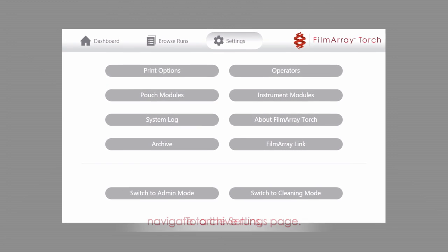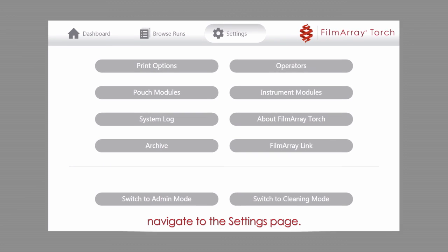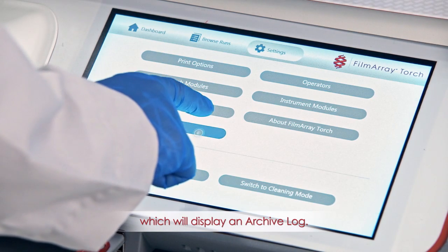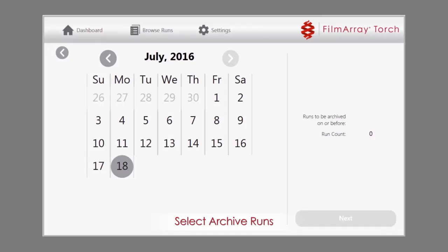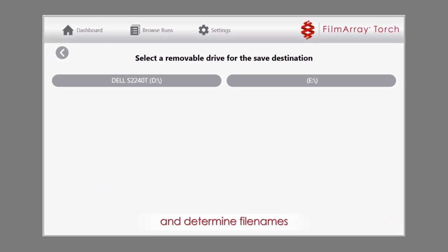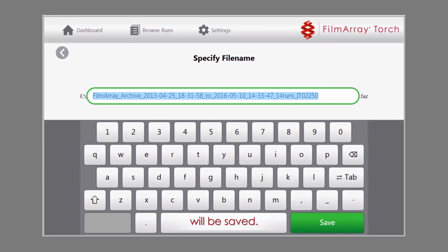Archive Runs. To archive runs, navigate to the Settings page. Select the Archive option, which will display an archive log. Select Archive Runs, which will display a calendar. Select the date you wish to archive the run. Select Next and determine file names and where the archived runs will be saved.